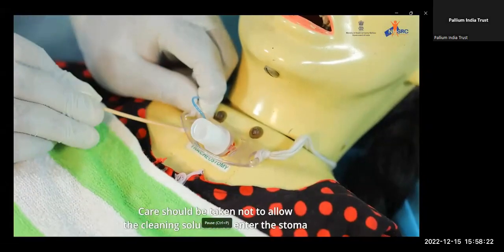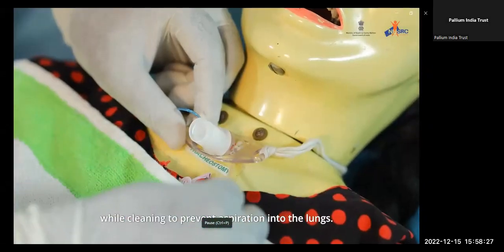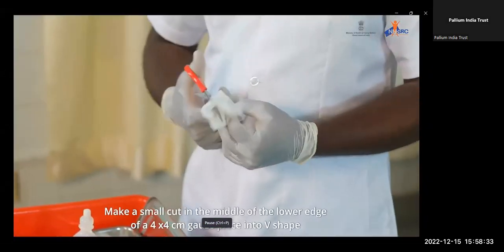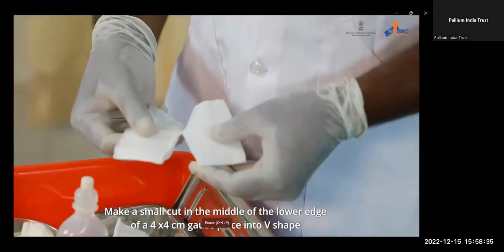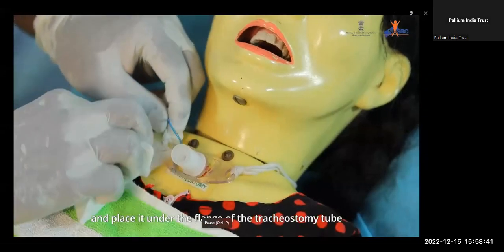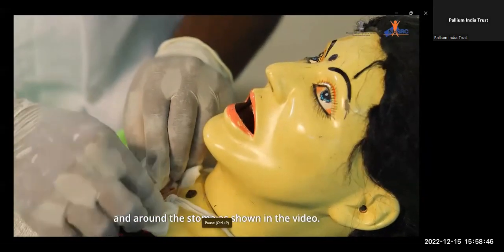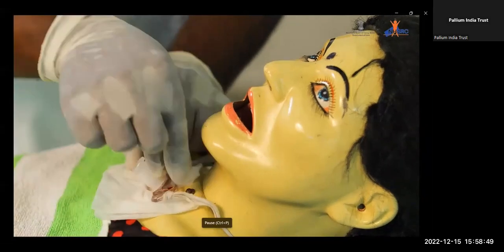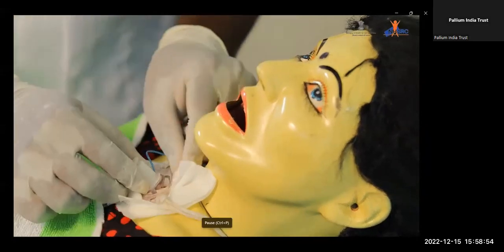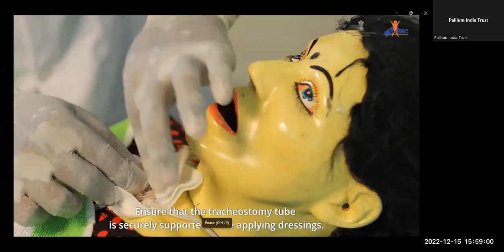Care should be taken not to allow the cleaning solution to enter the stoma while cleaning to prevent aspiration into the lungs. Make a small cut in the middle of the lower edge of a 4 x 4 cm gauze piece into V shape and place it under the flange of the tracheostomy tube and around the stoma as shown in the video. This ensures that the stomal skin is covered well. Ensure that the tracheostomy tube is securely supported while applying dressings.